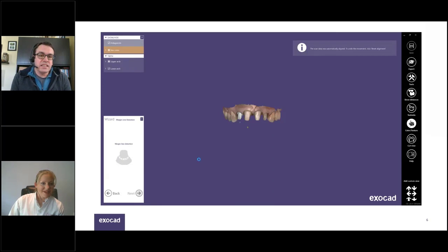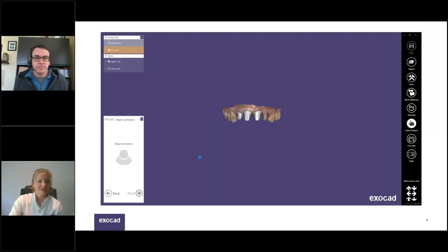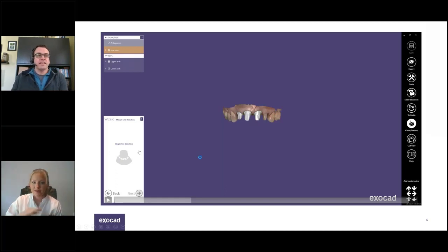One of the things I like about how you guys have formatted that is you can actually choose it to optimize for your particular printer in there as well. So you guys have added quite a few printers, and you won't have to dial in your settings. Yeah, good point. So at that screen where we chose the type for the model, we can choose a specific printer option there and have those settings preloaded and preset.